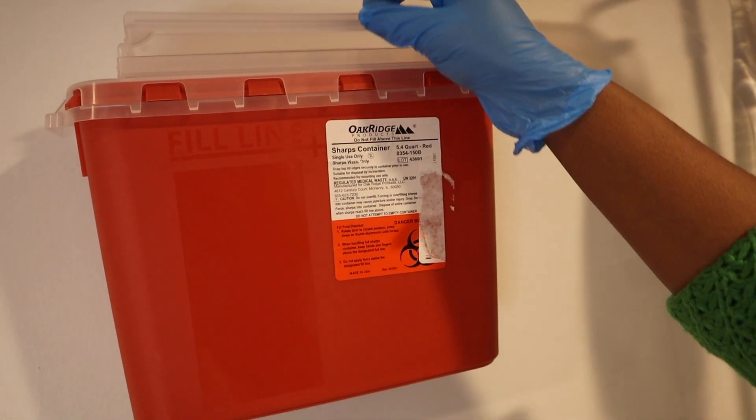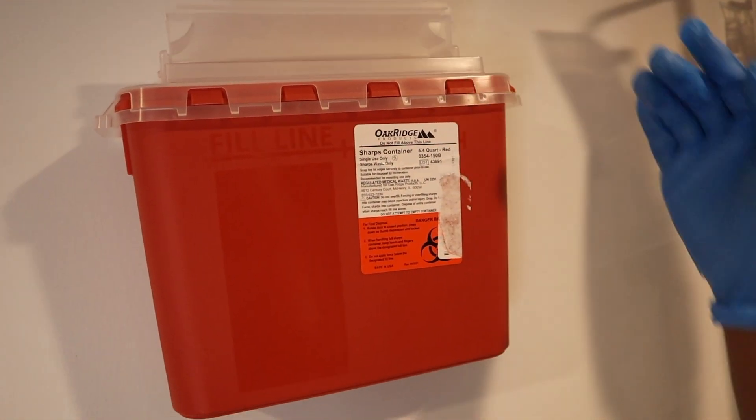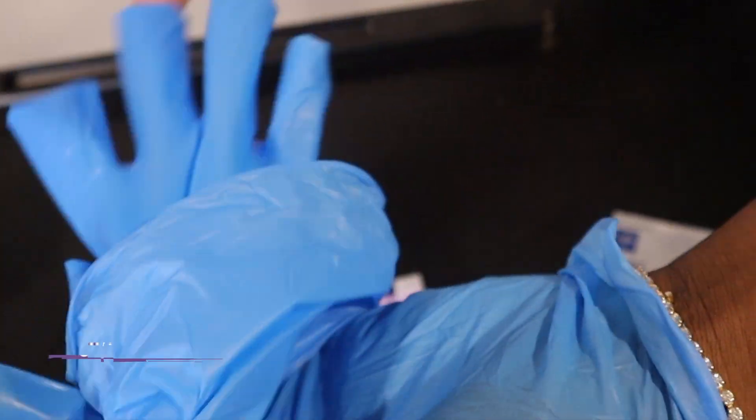Last but certainly not least, we want to remove our test strip from the glucose meter, take our used lancet and used gauze, and dispose of them in a biohazard container. Then doff your gloves and perform hand hygiene.